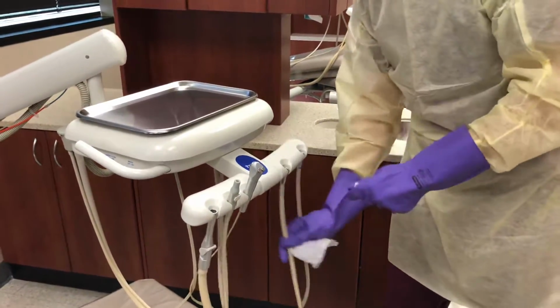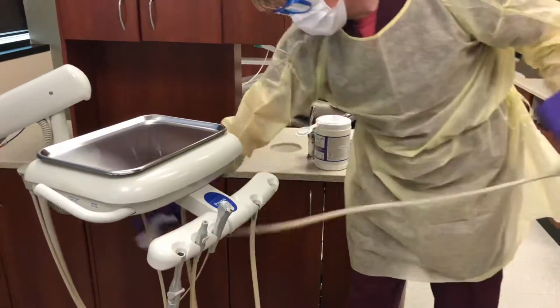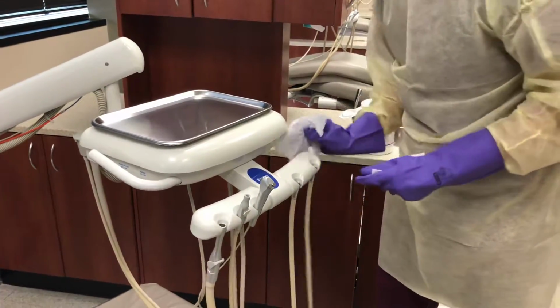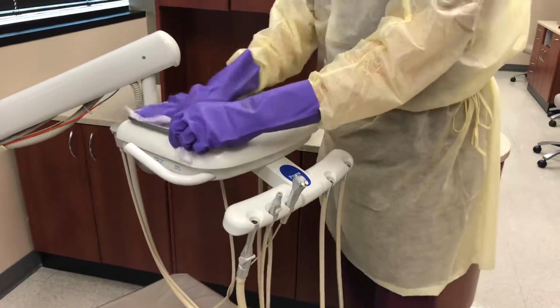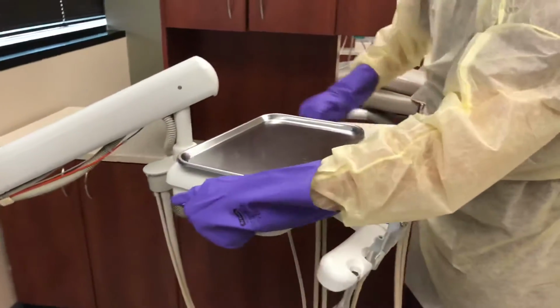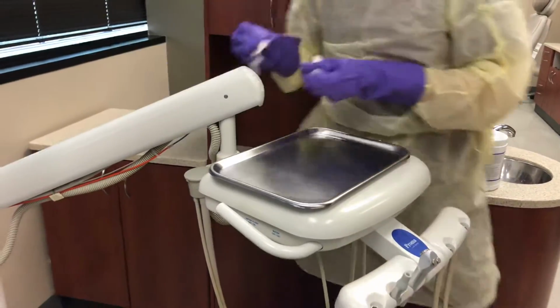And again, you go as quickly as possible for time's sake, but you are also efficient in not skipping steps. That was a little rubberized mat that helps keep that silver bracket tray from sliding off.